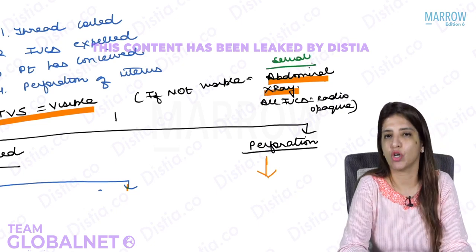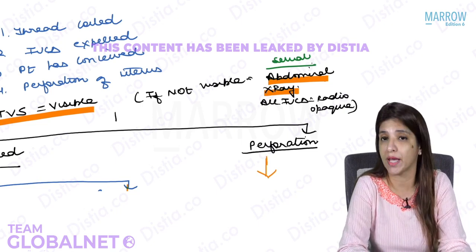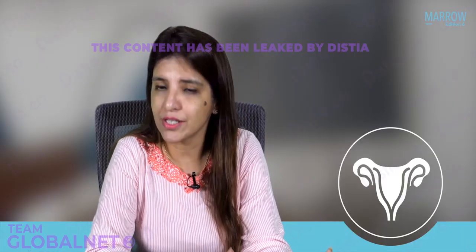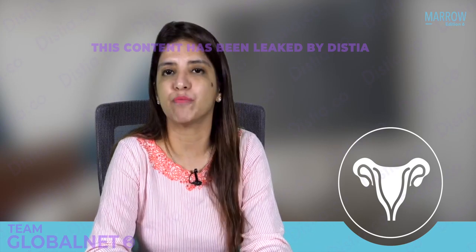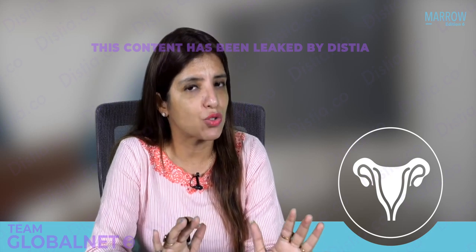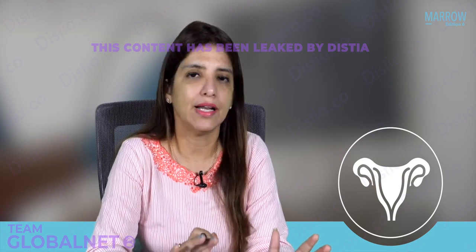When you do serial abdominal x-rays, because copper T's or any intrauterine contraceptive device is radio opaque, you will be able to see it in any one of the films. Right? So the first investigation whenever a female comes to you with missing threads is TVS. And if on TVS you cannot see the IUCD, then you should go for abdominal X-ray.